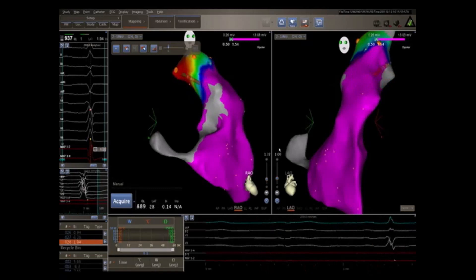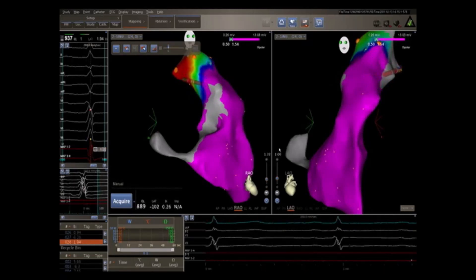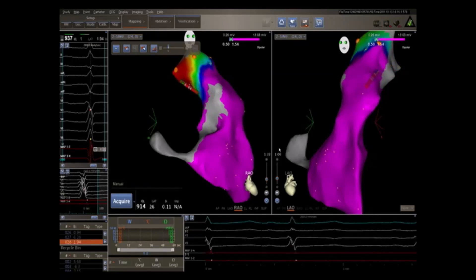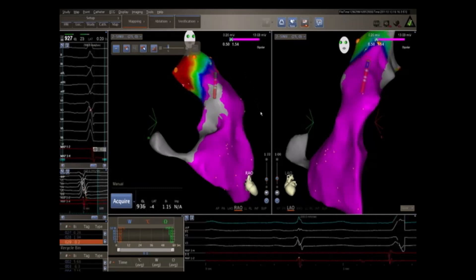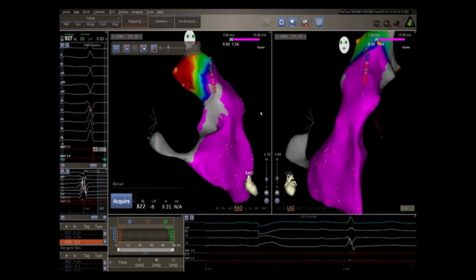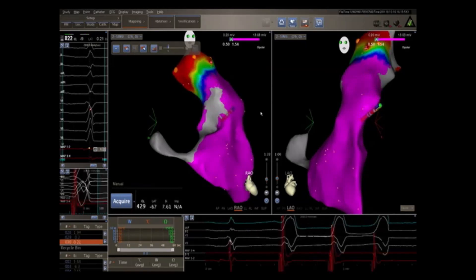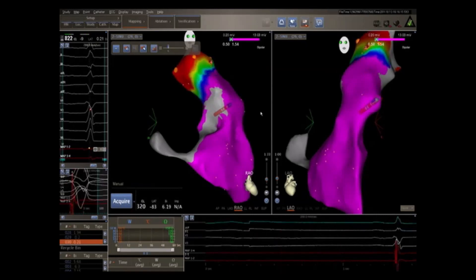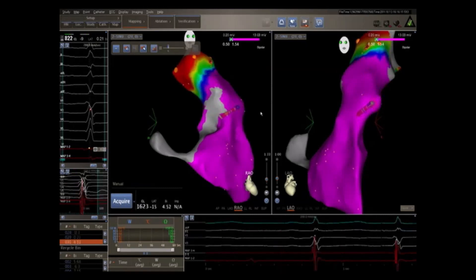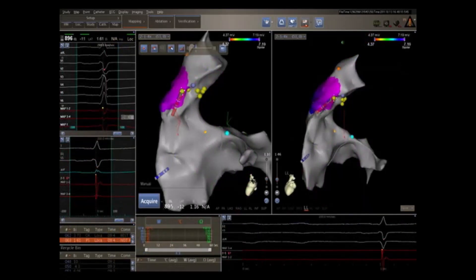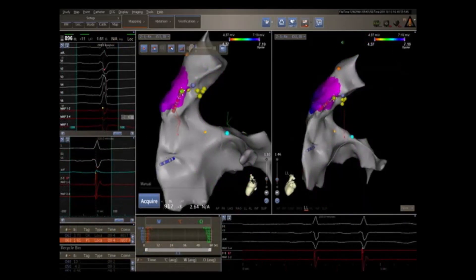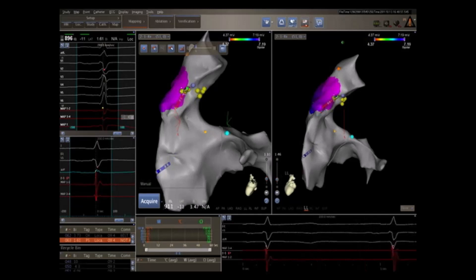Areas of purple show normal voltage set at an amplitude above 1.4 millivolts, while areas of red with an amplitude less than 0.5 millivolts show low voltage consistent with scar, or as in this case, the pulmonic valve. A second electrophysiology catheter, seen in blue in the left video, is then advanced into the right ventricular apex.